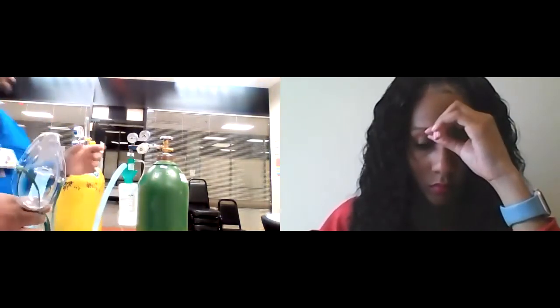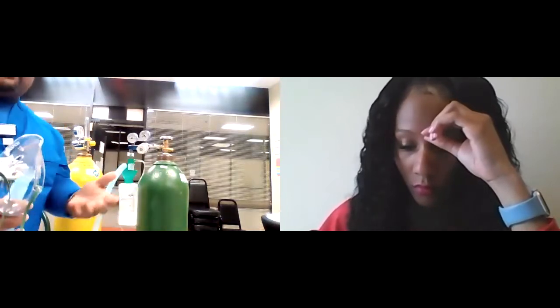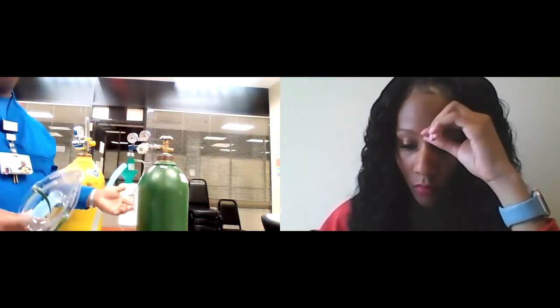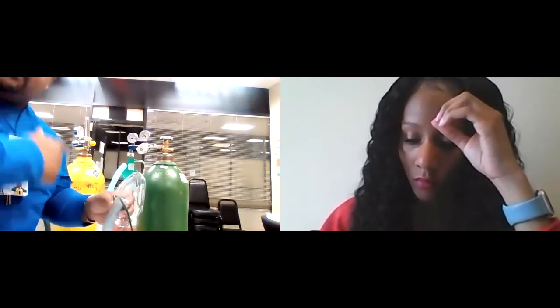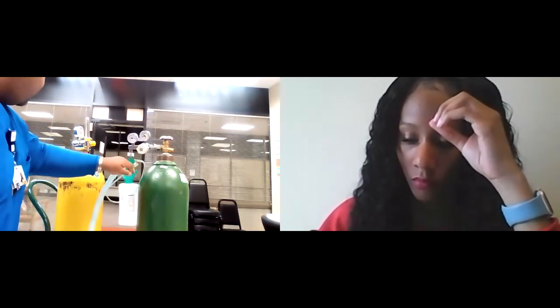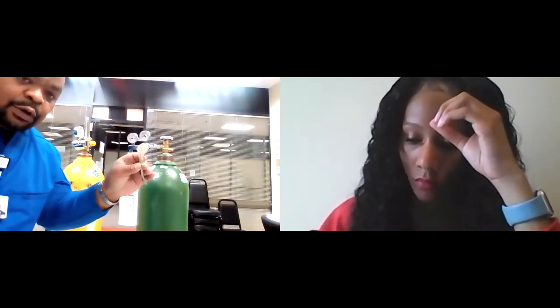Right now, I don't need the formula to find out the FiO2. The FiO2 is simply 100%, right? Because there is no Venturi on this. This is straight from the tank. But I don't want 100%, right? I want to bleed it down some, okay? But now I need my other system. And so on this one, notice that this Gen nebulizer has a connection here. See that? That will go directly onto the flow meter of the other system.